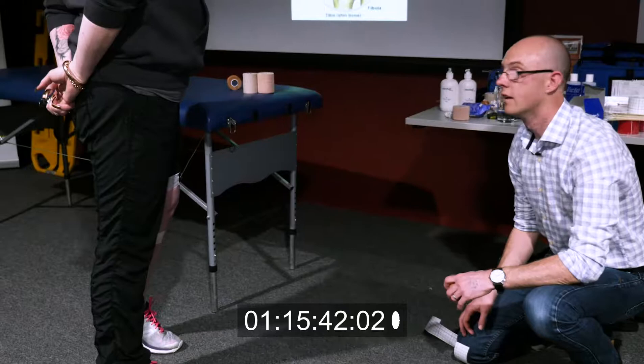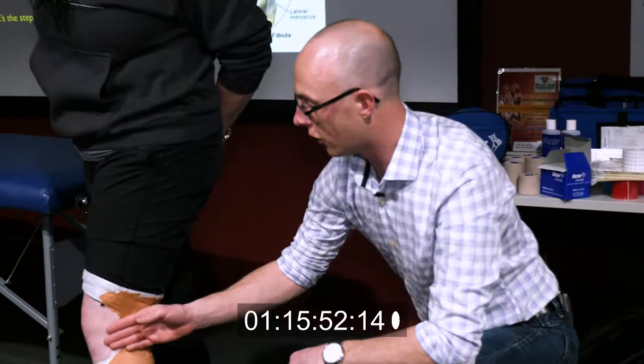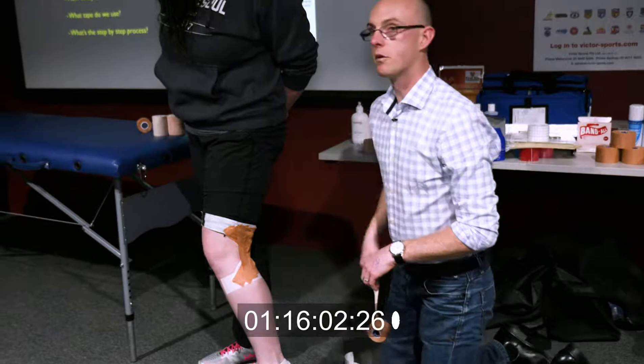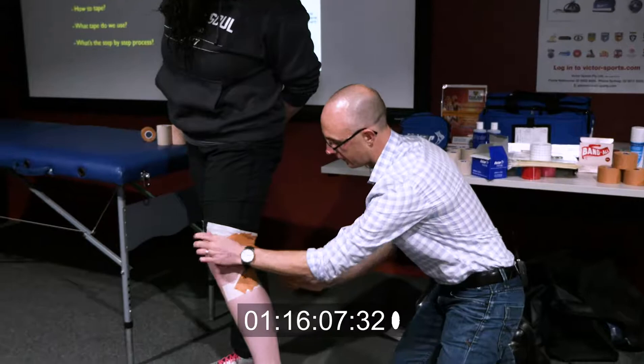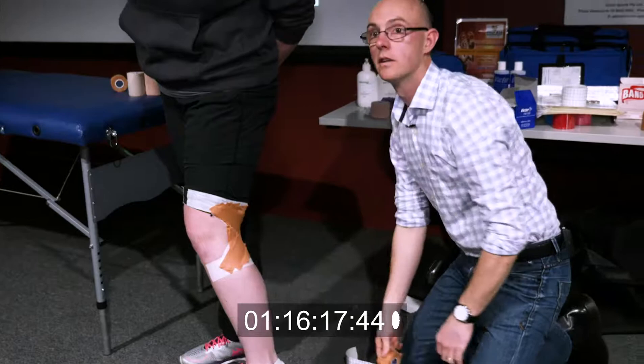Now we're going to put some vertical strips on to really lock it out. When you put these on, make them slightly shorter than the distance between the two anchor points. I'm going to attach the bottom end and pull down while holding the top end. What you'll start to see is a bit of a drum effect — there's a slight gap. Then go back the other way and do exactly the same thing. On top of that, I'll rehash over those crosses, putting another one around the back with good tension again. If we just leave it at that it'll come off, so we need to over-wrap.